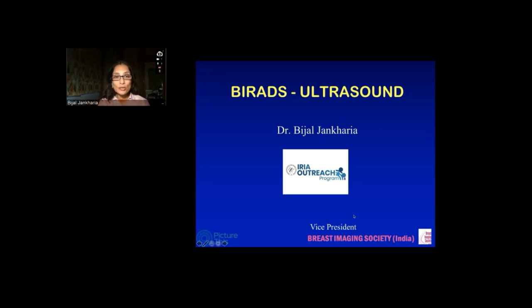So, thank you GE for giving me this platform. And today we are going to be talking only about BI-RADS and breast ultrasound. It's not going to be an exhaustive talk on only ultrasound, but specific to BI-RADS.